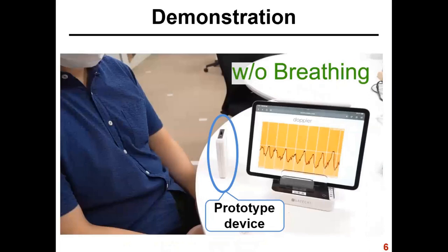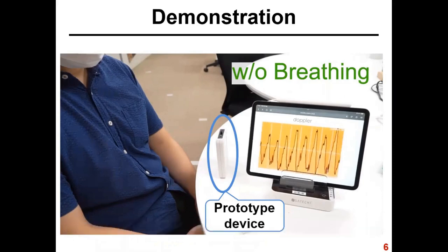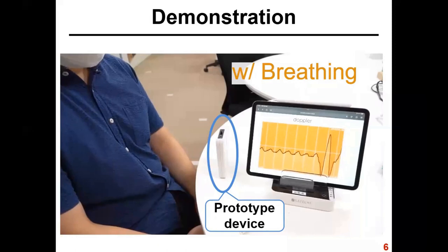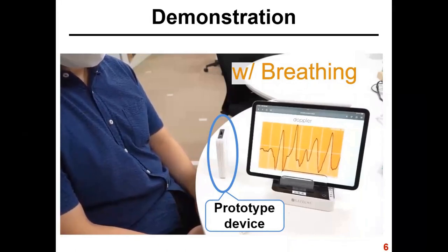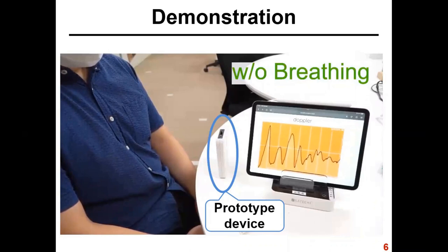This movie is a demonstration of heartbeat monitoring with a prototype device. The heartbeat component is clearly monitored without breathing, but when breathing, the respiratory component is dominant because breathing causes a large chest movement compared with the heartbeat.